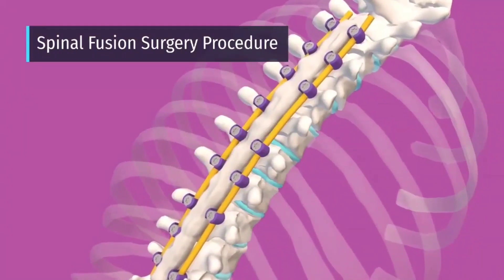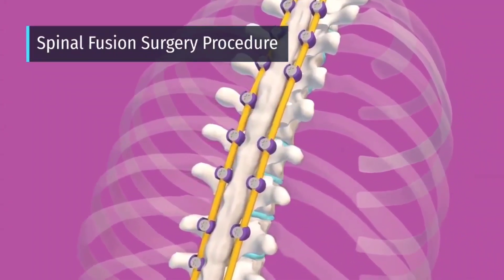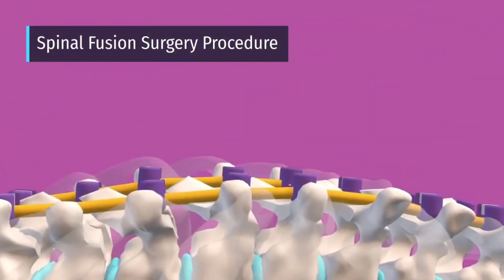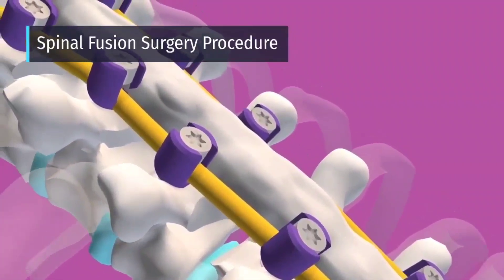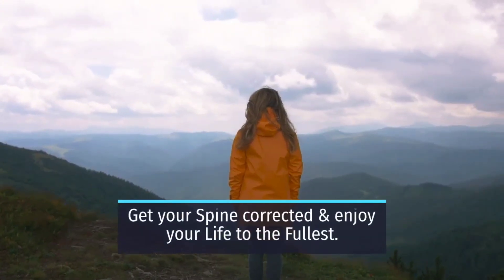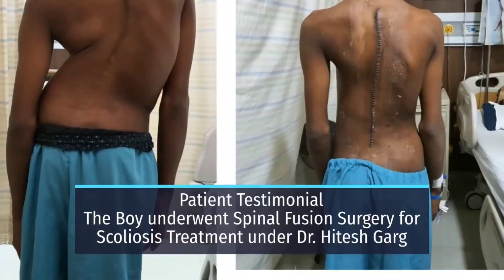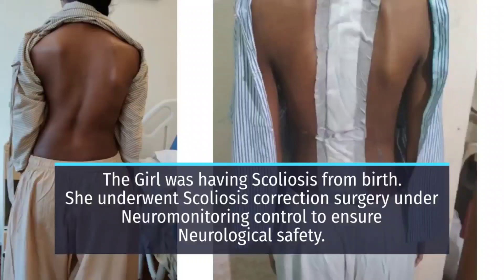These sources will depend on the surgical approach and will likely include a combination of the bone removed from the spine, such as the facet joints that were removed in the beginning, and the spinous process. With time, the bone graft fuses or grows together with the existing bone and forms a solid column of bone in that area.